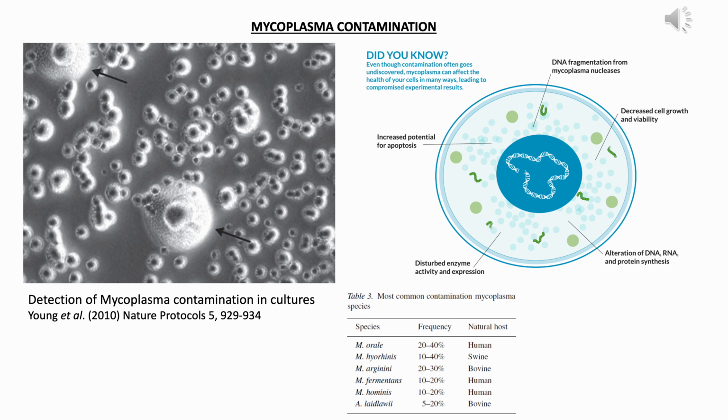Note that despite all these things, by using various methods of aseptic techniques, contaminations are still possible. Okay. And the three methods that I have already described: looking at the culture media for turbidity, looking at the color of the media, and looking for microscopic changes, morphology. These are golden things that one has to always check every day, in order to catch any early contamination or to be aware that the cells are perfectly healthy.